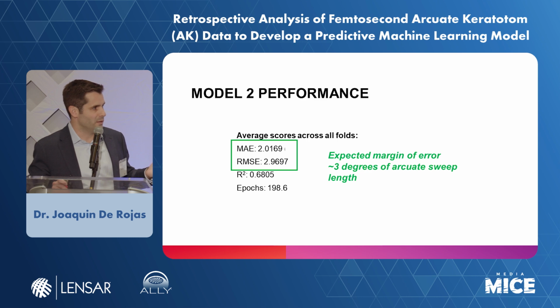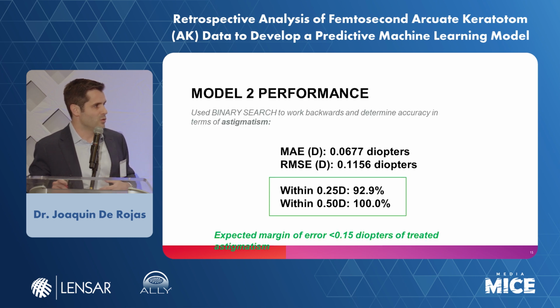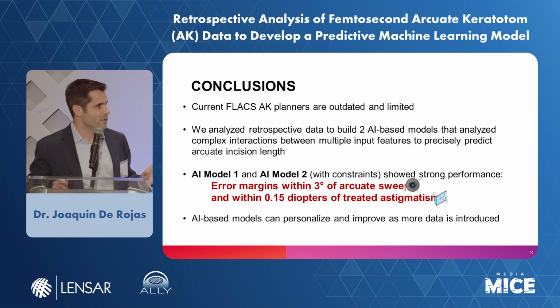Now it's within 3 degrees of arcuate sweep length. And if you work backwards, you can expect the margin of error of the treated astigmatism to be within 0.15 diopters. So in summary, for the current planners, there is some room for improvement. They've done really well, but you always want to see if there's anything else you can do. We analyzed retrospective data to build two AI-based models to analyze these complex interactions between multiple input features. Really, the sky's the limit with this. You can add more and see what happens. You test the model and try different things. You were just asking about the interplay with the Cassini, and this is a perfect application for that.